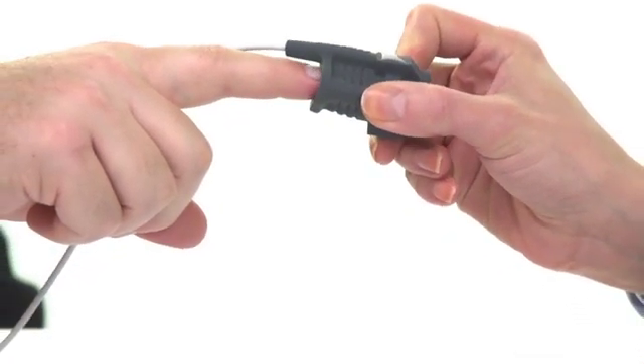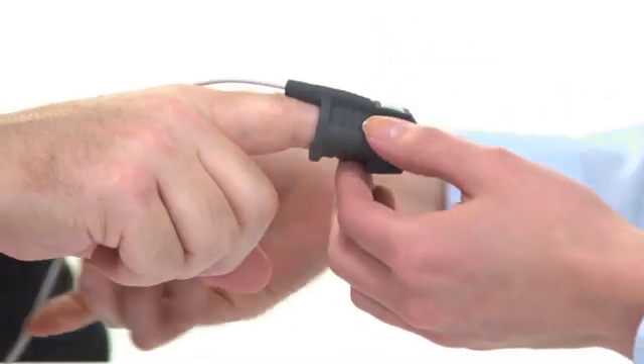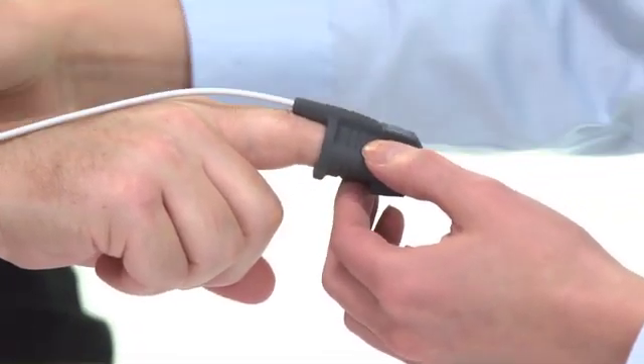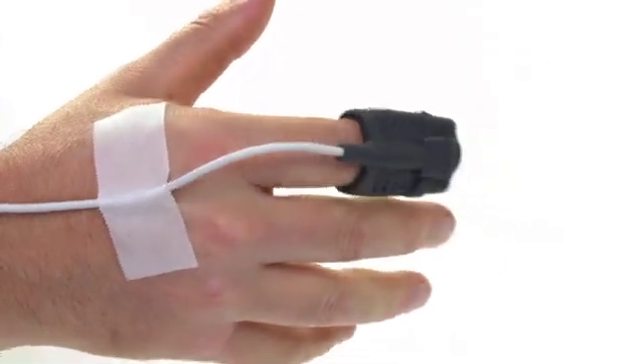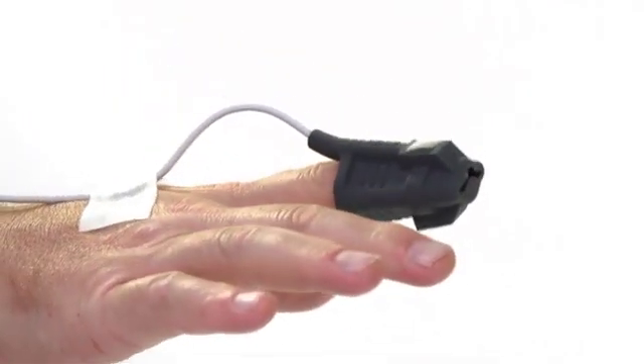Prepare the sensor and place it on the patient prior to connecting it to the oximeter. Proper sensor placement is critical for accurate readings. Follow the instructions for each sensor type to ensure secure, aligned positioning of the sensor on the finger or skin surface.